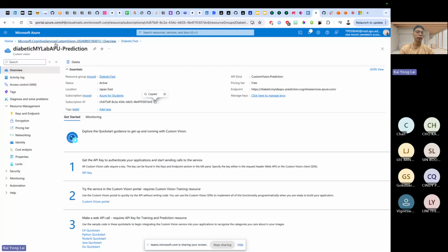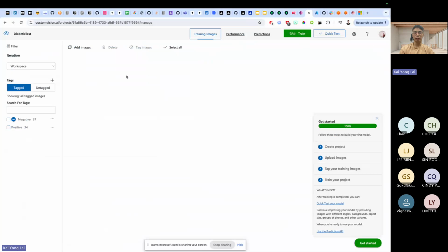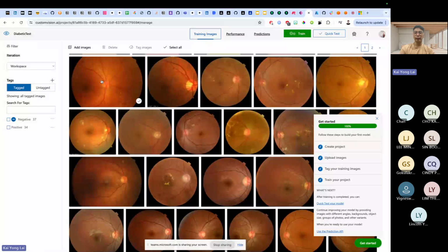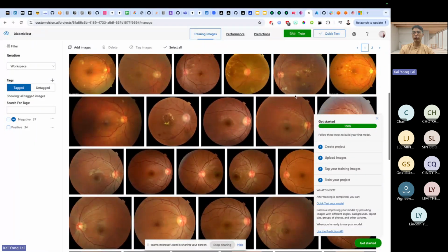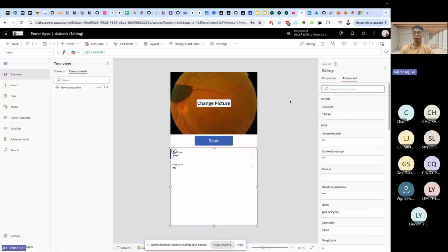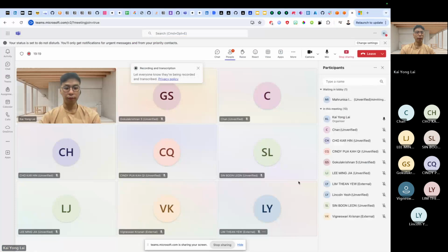This is how it looks. This is the Custom Vision service that we need to build, where we store our data. This is how the data looks on the diabetic retinopathy training data that we need, and then the predictions. This is your eyeballs, and you will see whether you are facing diabetic issues. And of course, this is the application that we are going to build.